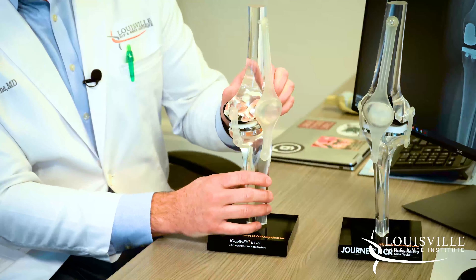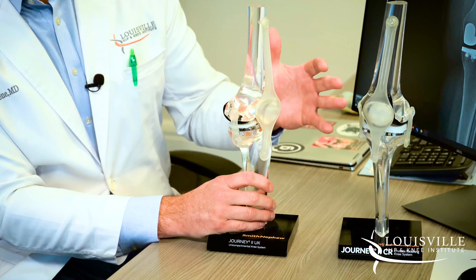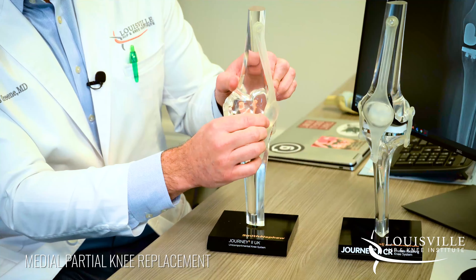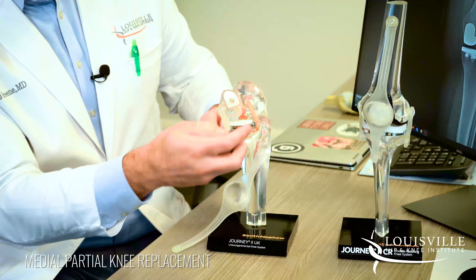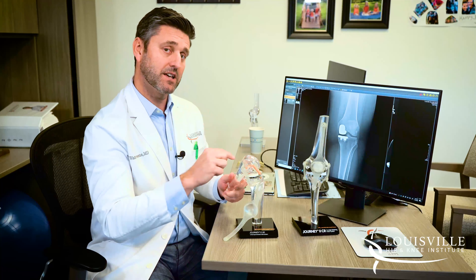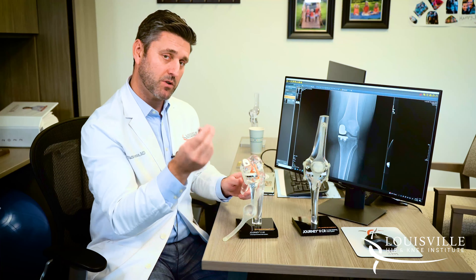Here is a model of a partial knee replacement. The clear parts represent your bone as you were born with it. In a partial knee replacement, we go in and move the kneecap to the side — we do not cut tendons or muscles. We go in and remove just the worn-out cartilage on the affected side, taking out small pieces and getting rid of the arthritis to get down to the healthy bone. Then we cap the ends of the bones with metal.